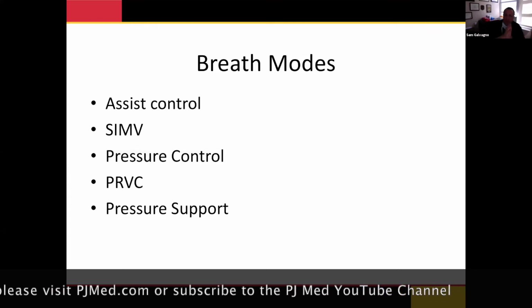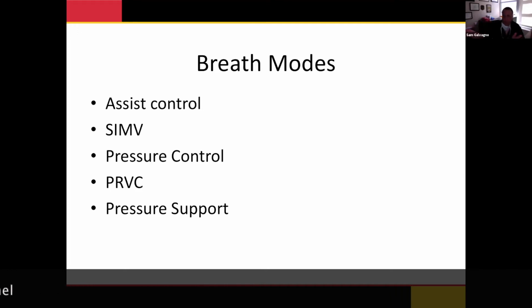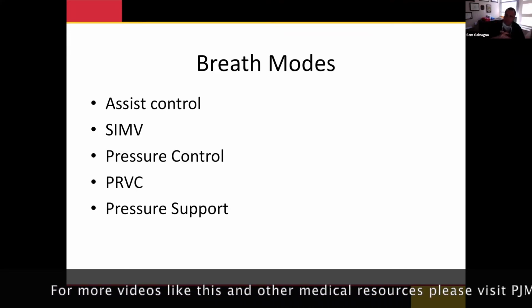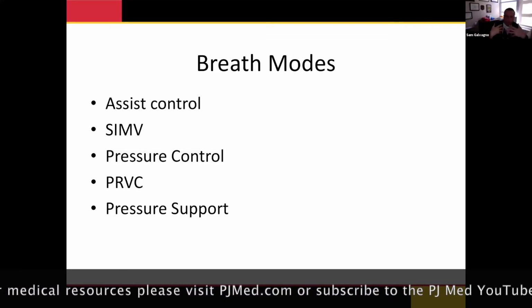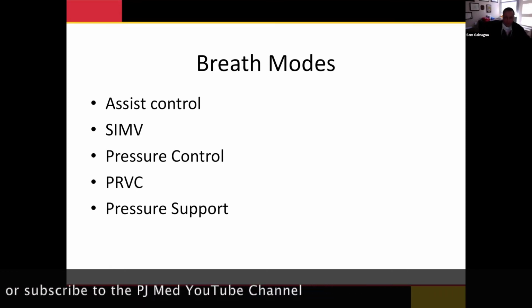I don't have APRV up here because, again, that is an entirely different animal, and I don't want to overwhelm you with advanced stuff. Although I would argue that's one of my favorite modes personally. I think it's a really good mode for a lot of physiologic reasons. So maybe in the future, if you guys really want to get more advanced with this stuff, I'm happy to talk about it or have one of my colleagues talk about it to you, okay? But these are our foundational modes.